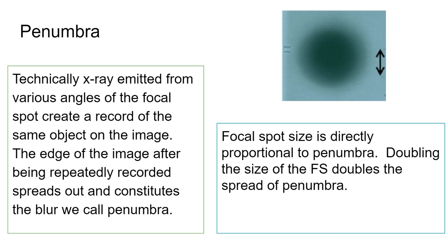So essentially, if we drew a circle around this, okay, and this umbra here is another circle inside, right? What happens is by reducing the penumbra, the umbra actually grows. So this inner circle extends, right? So there is no overall magnification change, right?